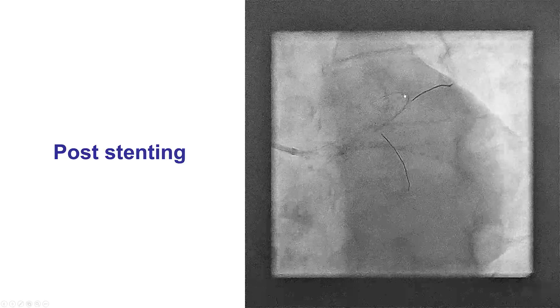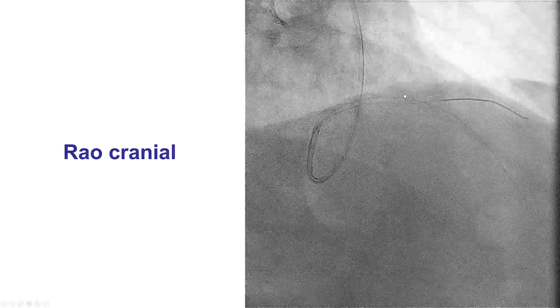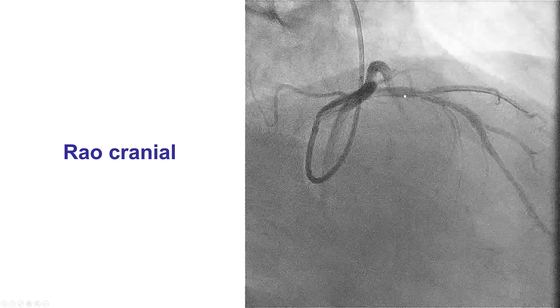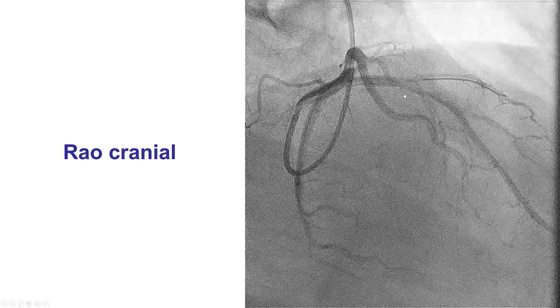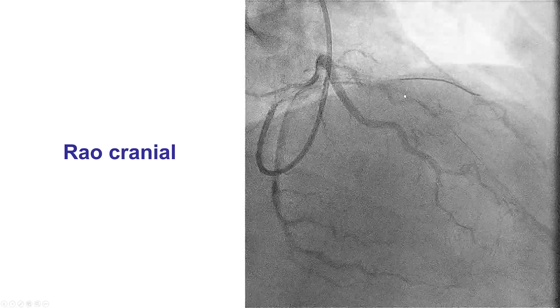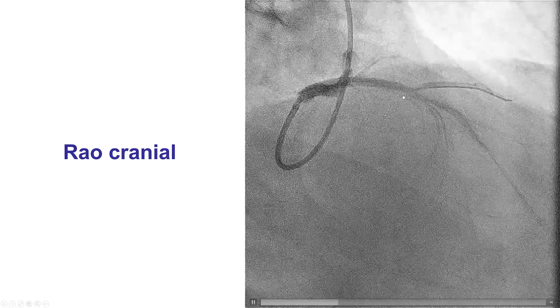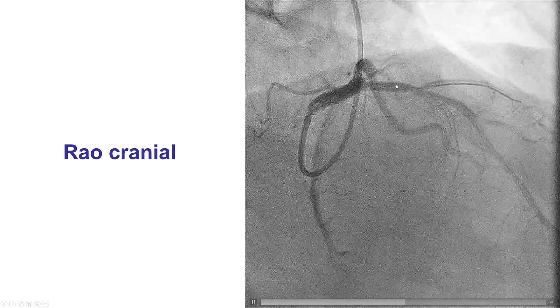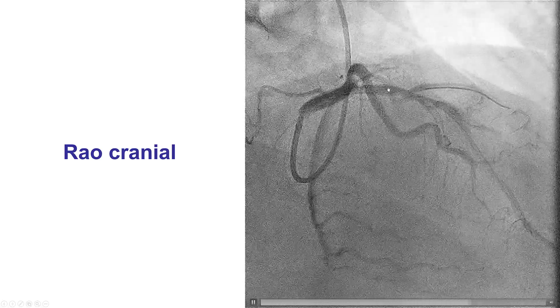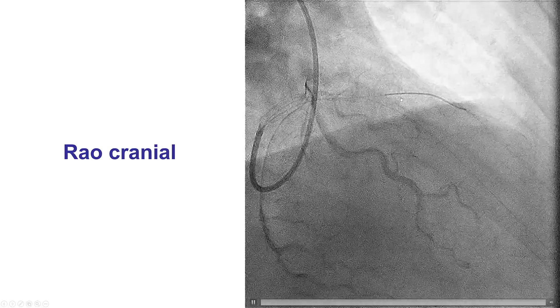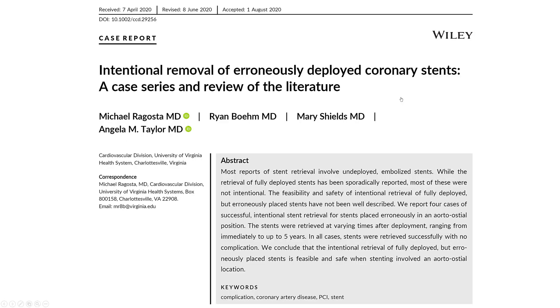There was good flow afterwards, so we didn't have to worry about that. This view shows that we had now missed the lesion — there is some geographic miss because we didn't cover this portion of the LAD.